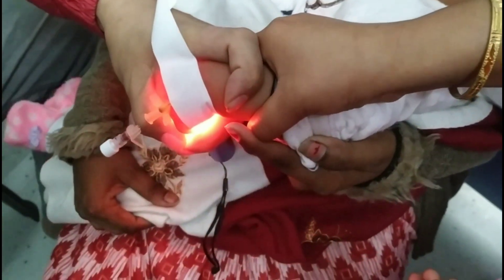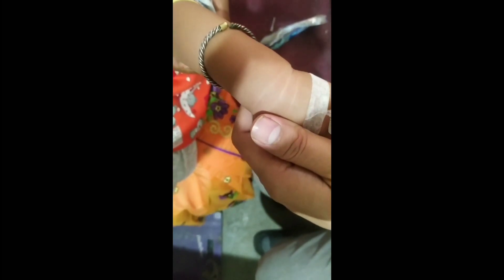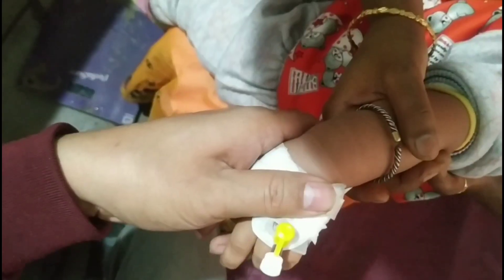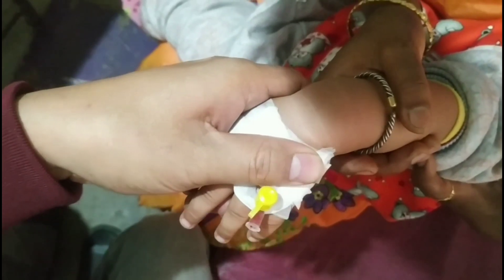Baby's and kids' skin is quite thin as compared to adults, so the infrared light can pass through the skin easily. The hemoglobin of the blood running through the vein absorbs the infrared light and makes it more visible to eyesight.